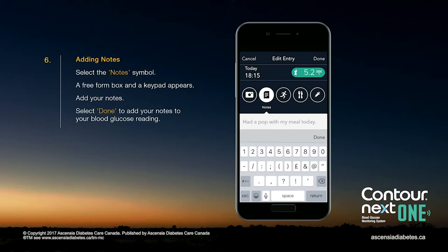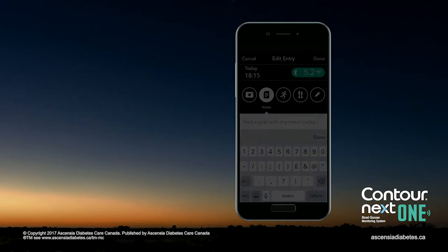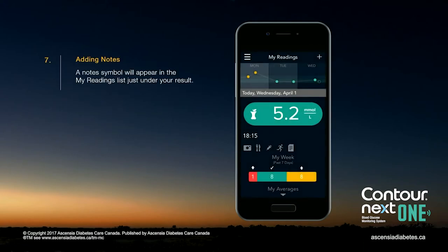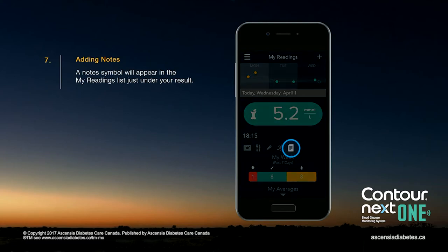Add your notes, then select Done to add your notes to your blood glucose reading. A note symbol will appear in the My Readings list just under Your Result.